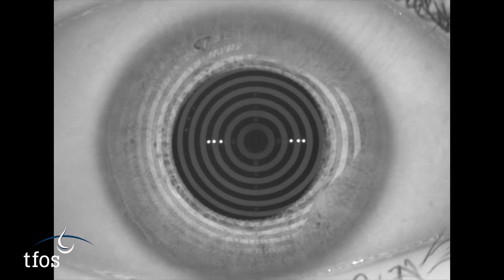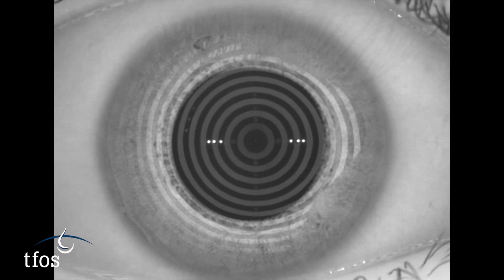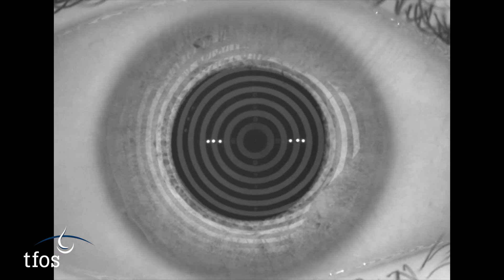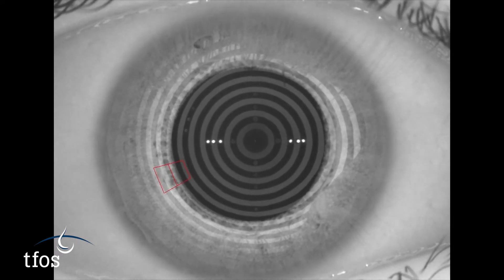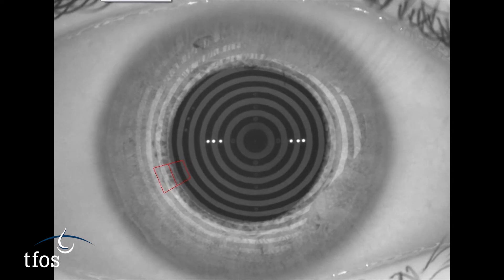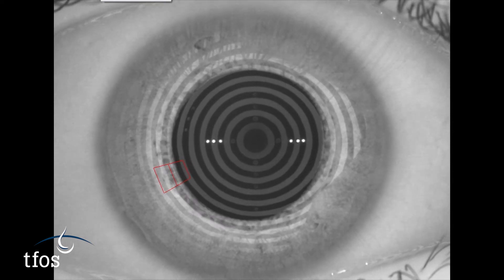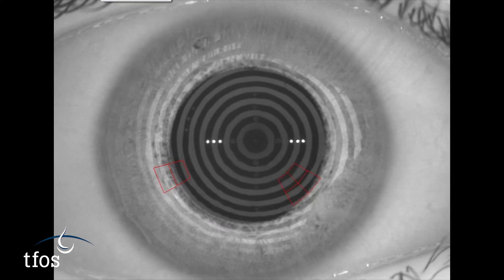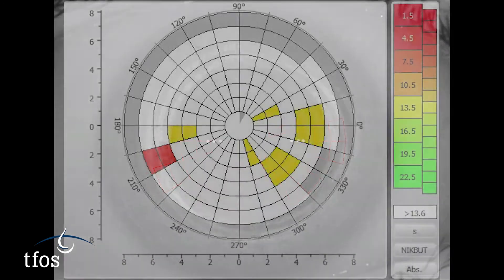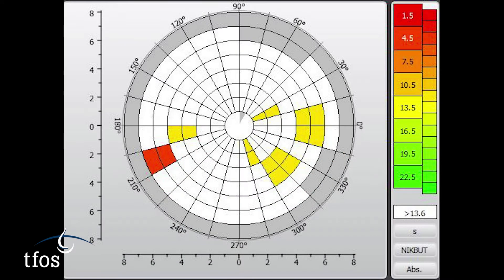Corneal topographic instrumentation can allow objective assessment of the placido disc distortion that occurs with tear film thinning and break-up. Real-time image analysis algorithms can highlight these areas following a blink, as seen in this video. A map of the areas that break up over the ocular surface over time is generated, along with an overall break-up time profile.